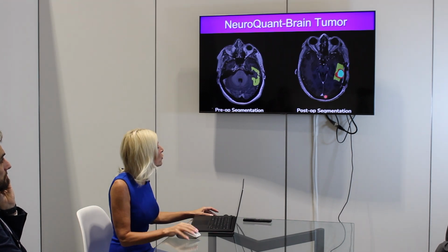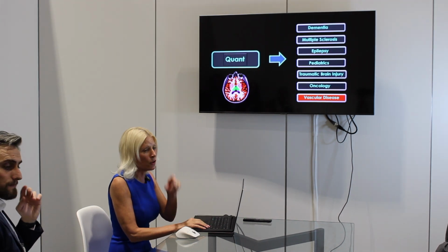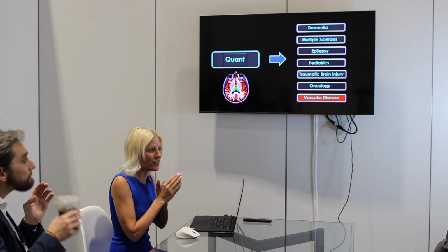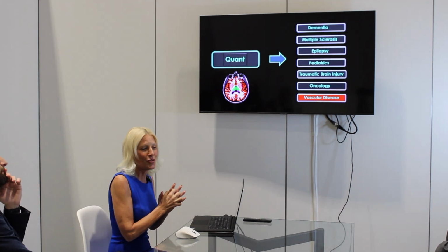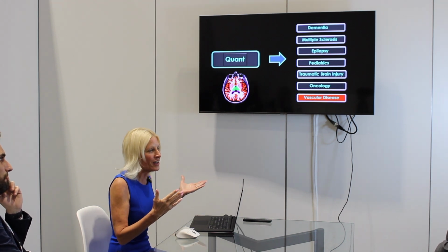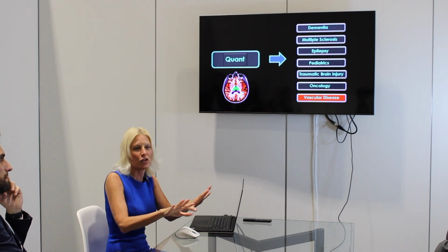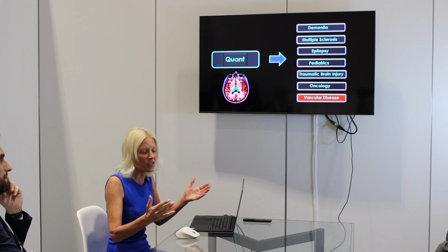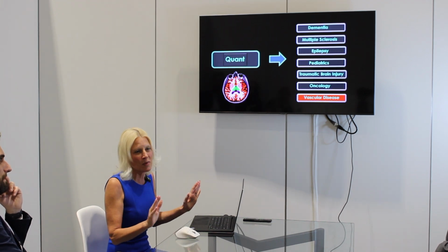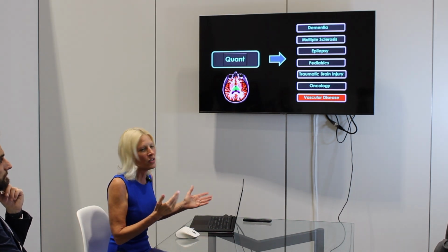So extremely useful. And so this basically segments for high-grade gliomas and low-grade gliomas, but we're developing it for meningiomas and metastases. So stay tuned for Q1 of 2025. Again, meningiomas are a dime a dozen for us as neuroradiologists, and can be very difficult to measure accurately, particularly along the skull base when they grow in all kinds of different directions. We don't even really know the best place to place the caliper, and really these should be volumes. In the future, everything will be volumetric measurements, and just much more useful.